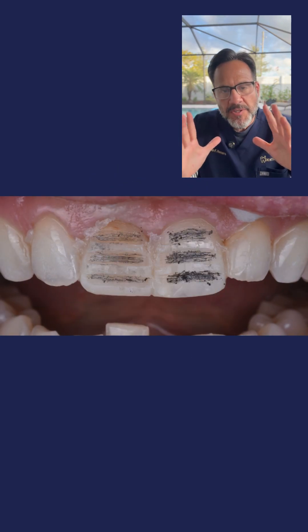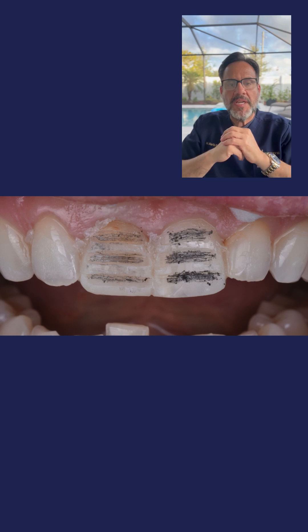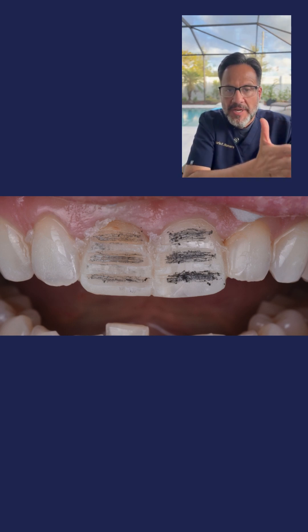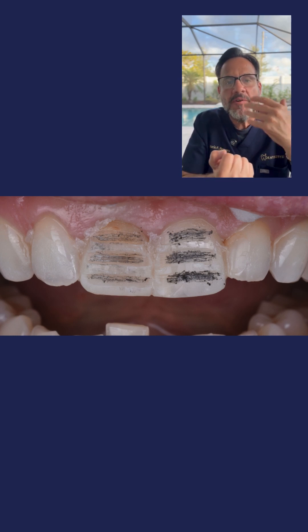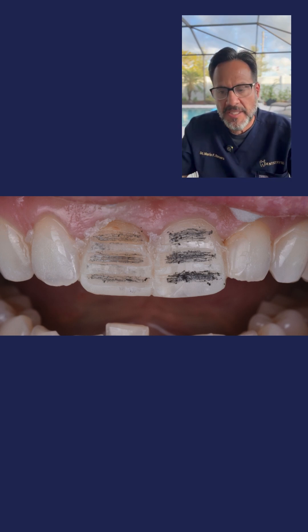How to control the depth of your preparation, part two. We were in photo number three, and just as a reminder, in photo number three, I have done three horizontal depth cutting guides within these teeth. Now don't forget, tooth number eight is darker than tooth number nine, so I have to have more reduction on tooth number eight in order for me to hide that intense or high color that the tooth actually has.